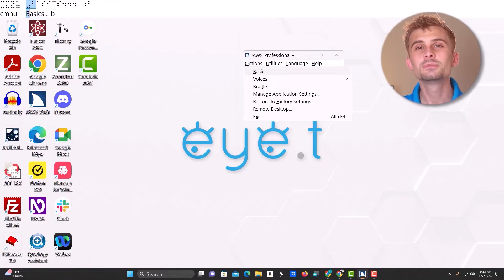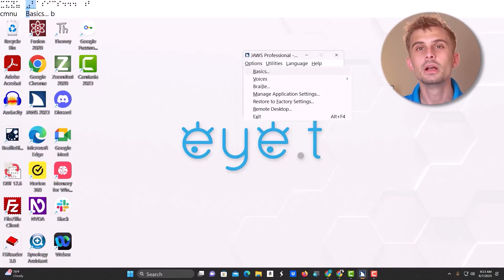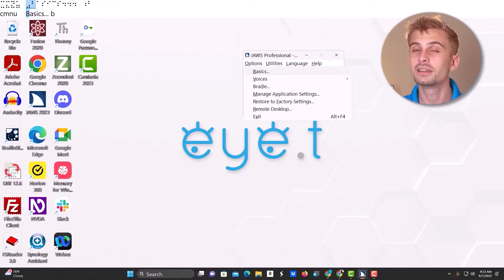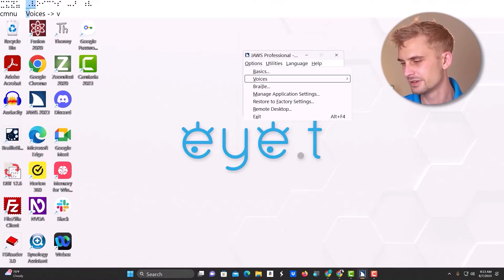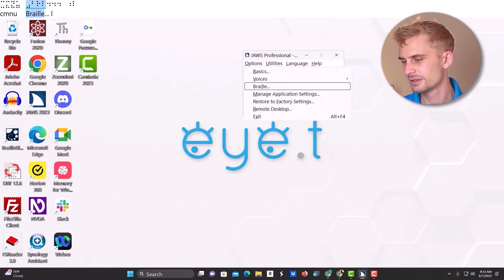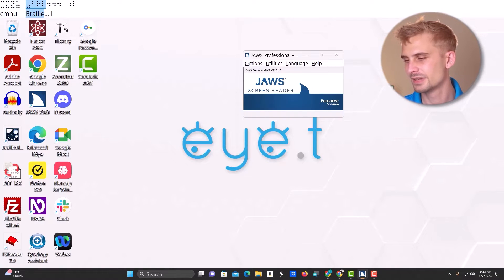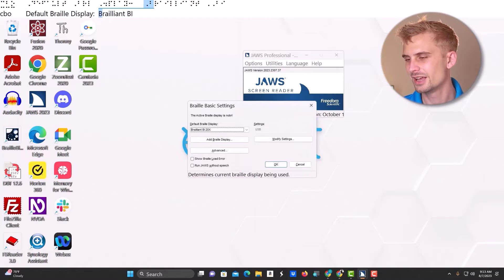Now I'm going to use my arrow keys to get to braille, and of course when I get there, press Enter.